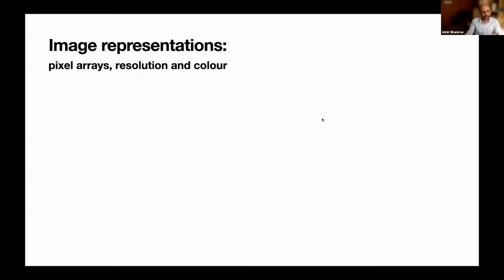So let's start with some fundamentals. There's been a lot of discussion today and some great talks where people have talked about whole slide images, but what exactly are they, and how do we represent them for the purposes of computation? Well, we can think of images as grids, and one definition is as a matrix. If you're a mathematician, you might call it a matrix.